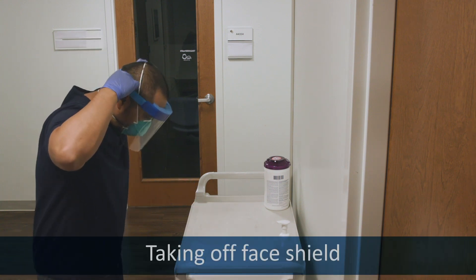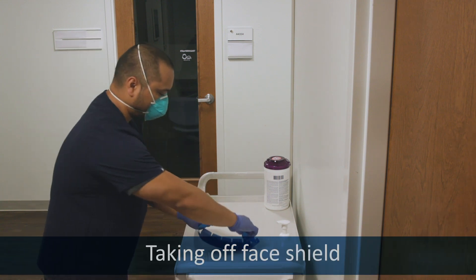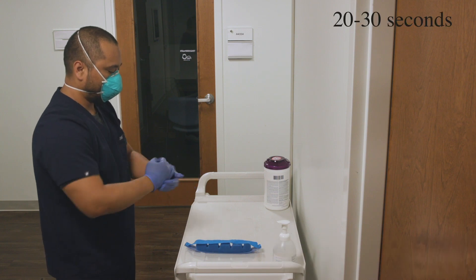Remove the face shield by the strap and away over your head without touching your skin. Sanitize your gloves.